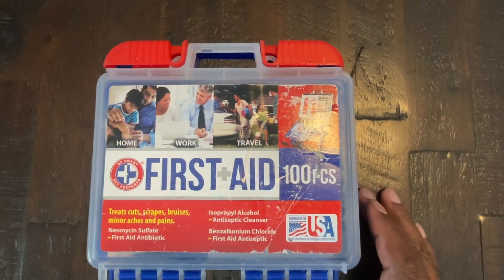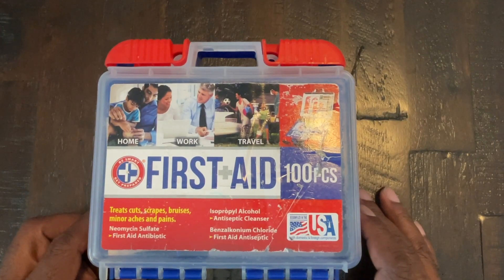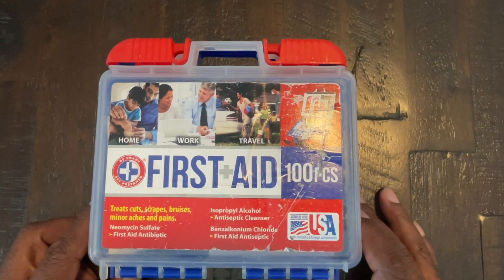Hey guys, it's Tony. Today I'm going to do a review on this Be Smart First Aid Kit. This is a 100 piece kit that comes with a number of things that you might need in an emergency.